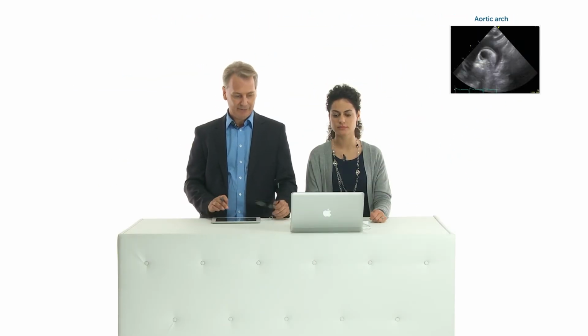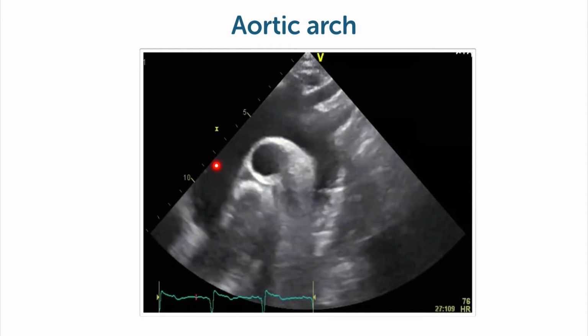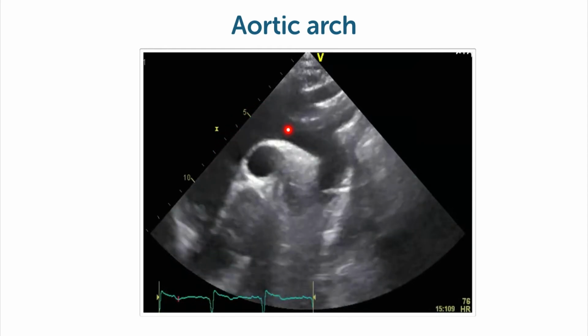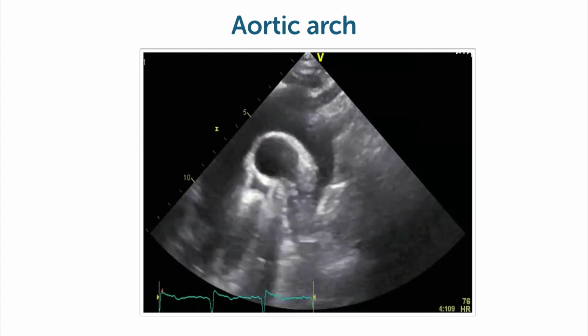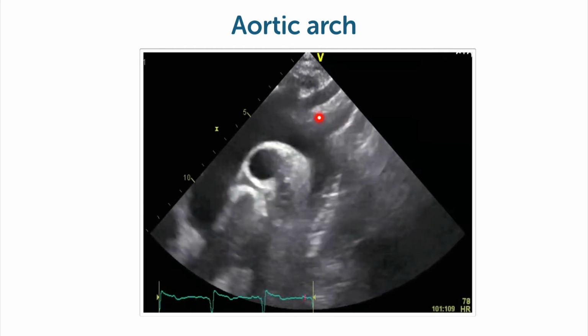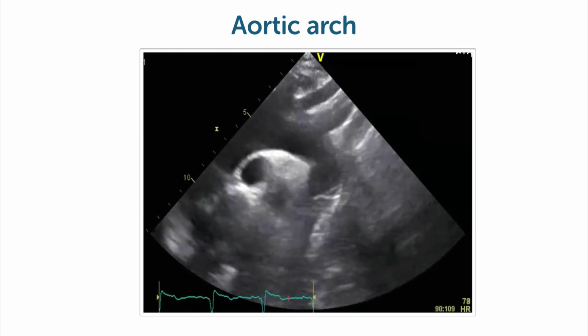So this is the view that we will get. We would have the aortic arch right here again with the ascending aorta, the arch itself, and the descending aorta. I think you can really appreciate that it's possible to detect dilatation here as well, and sometimes even dissection, because actually this region here is kind of a predilection place where you would frequently see dissection.